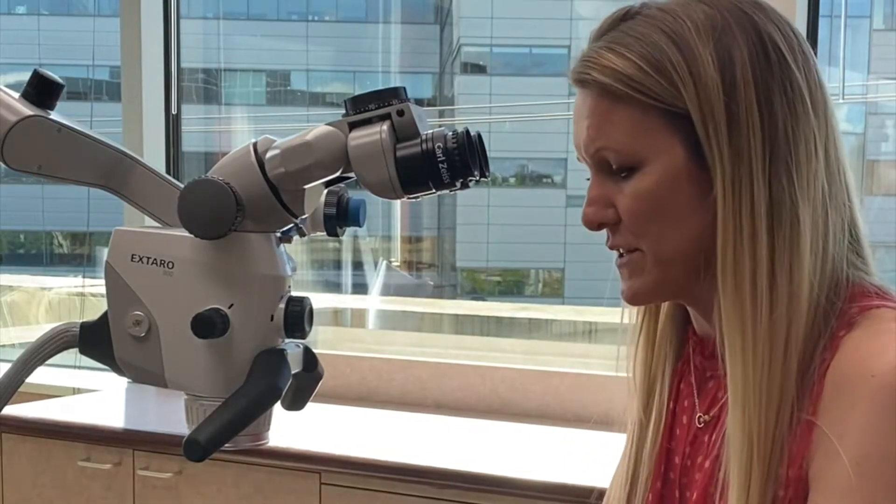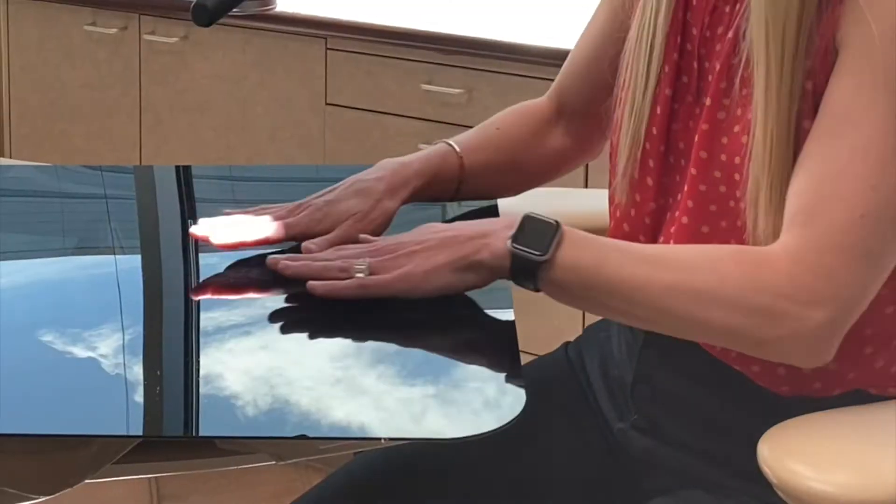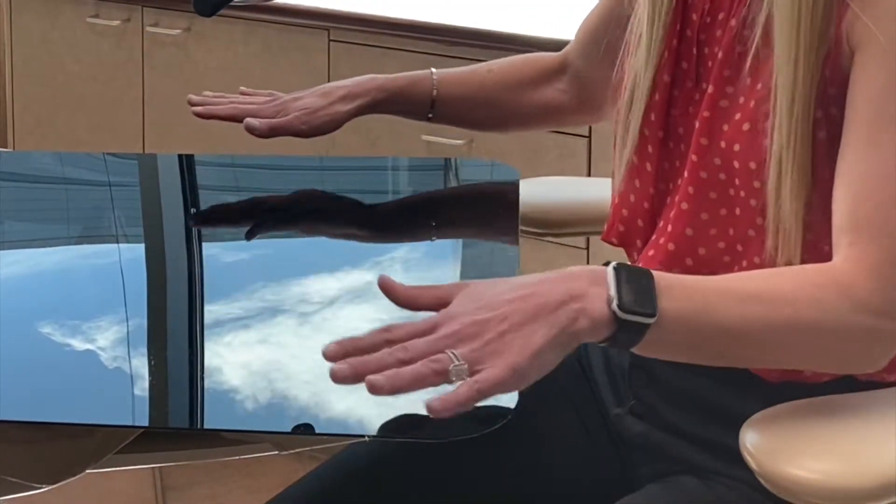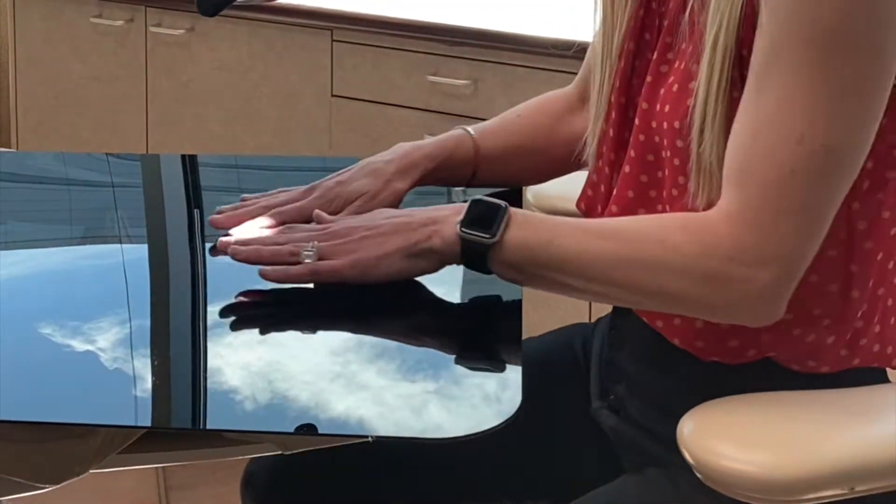I would never recommend setting this up over a patient to begin with — you would always do it outside of a patient's mouth on a flat tabletop. I've just taken a flat panel here and set it over my operating chair at what is a comfortable working height for me.